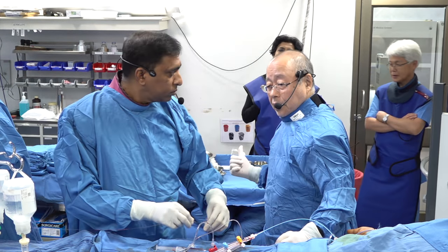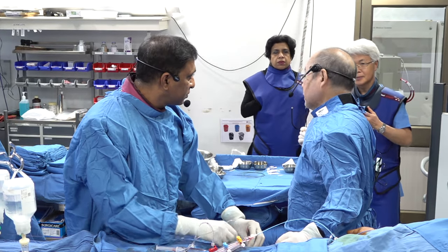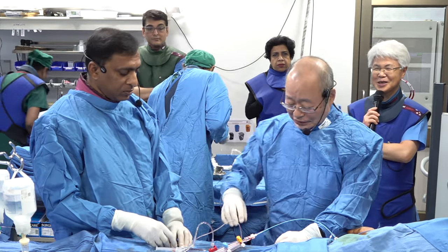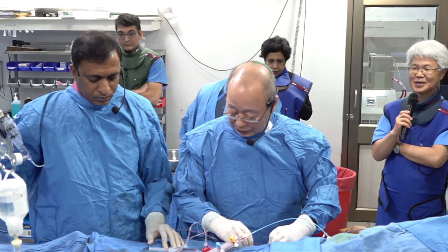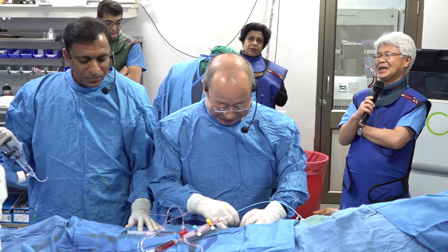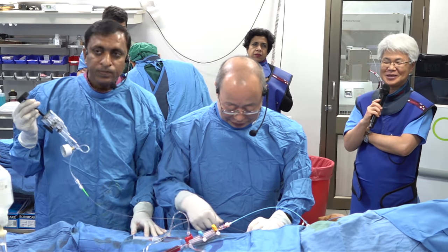Akasaka sensei, is dilatation with a 1 millimeter balloon enough to take an OCT image? Not too small? Too small, I see. At least 2 millimeter is ideal, I see. But I can try, no? Might be difficult in a case with the CTO. Okay, right.